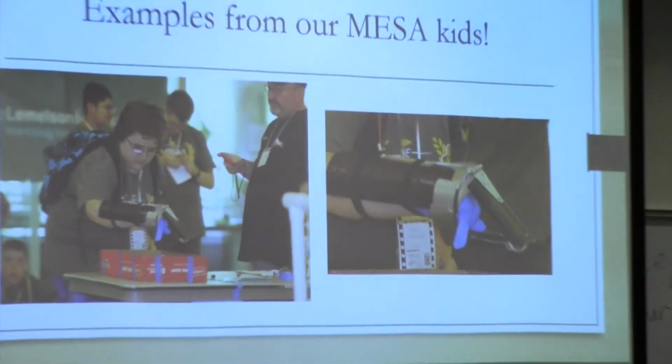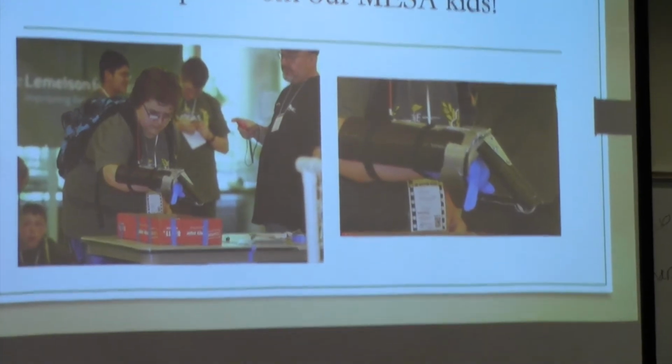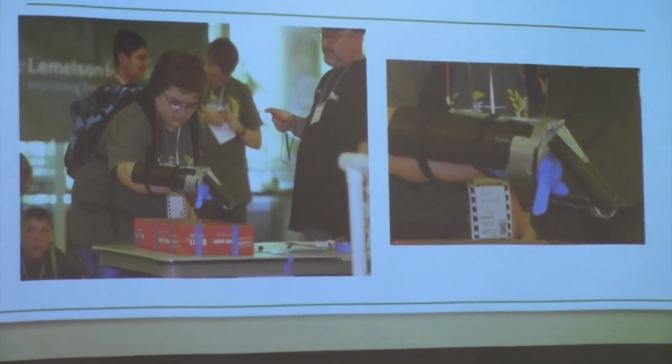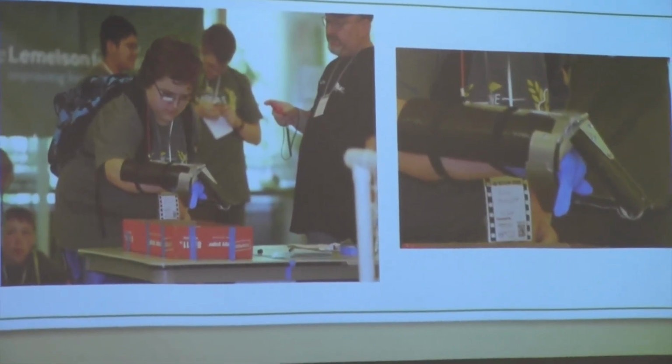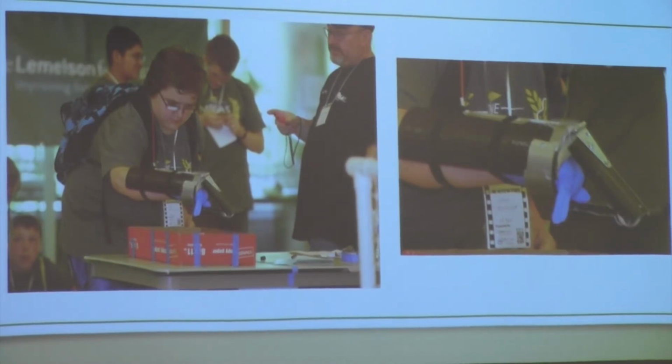And these are a couple examples. I went through some pictures of our Mesa kids, and a lot of kids have already started to get really creative and just try to do their own designs. I have a few that I want to share with you guys. So it doesn't have to look anything like that. This is just the example that I came up with, so you guys can see the different techniques you can use, how you can incorporate gears and springs, but it doesn't have to look anything like this. This is just an example.